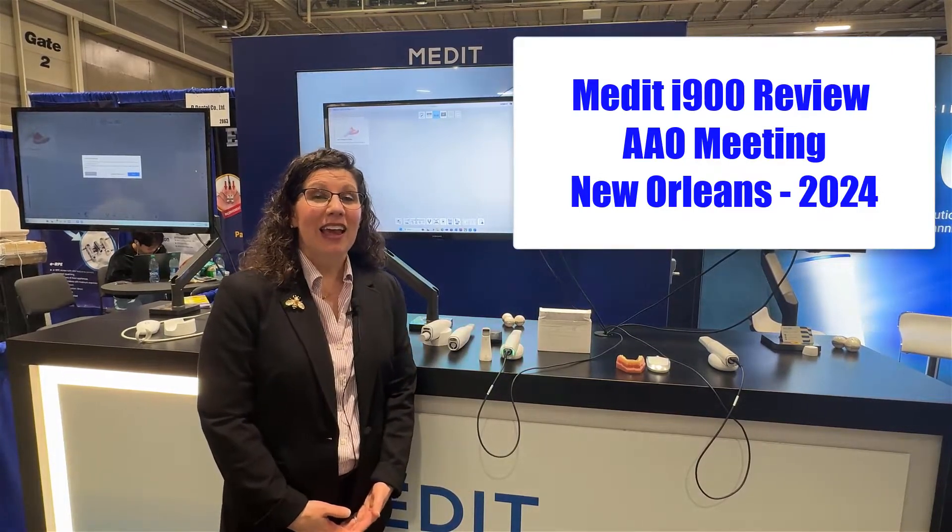Hi, this is Dr. Melissa Chotel, also known as the Aligner B, and I'm here in New Orleans at the American Association of Orthodontists meeting. There was some exciting news last week when Medit released the new i900 intraoral scanner, and I wanted to take a look at some of the new features.